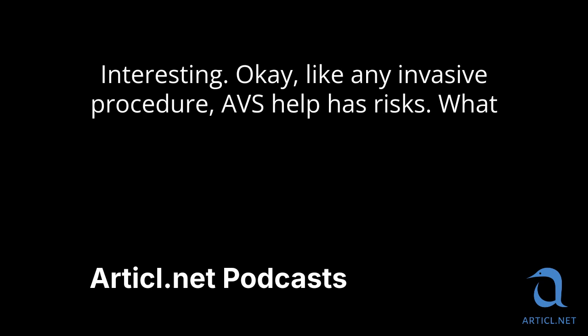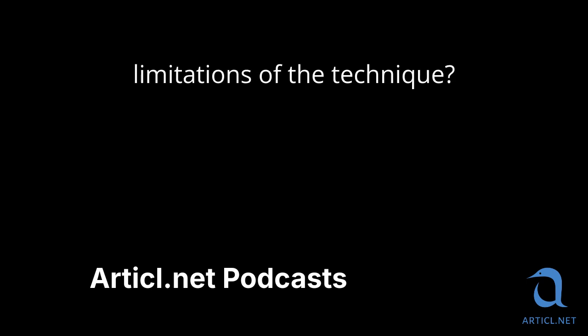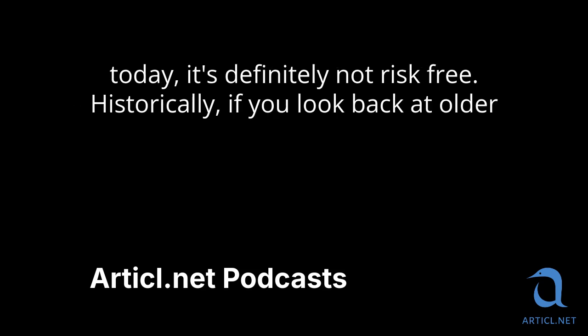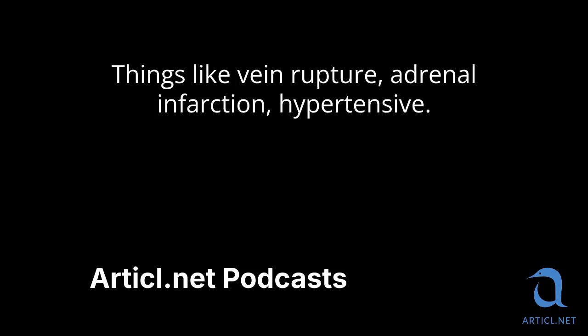Interesting. Okay. Like any invasive procedure, AVS has risks. What should we be aware of regarding complications and also the inherent limitations of the technique? Absolutely. While AVS is generally considered safe in experienced hands today, it's definitely not risk-free. Historically, if you look back at older papers, complication rates were reported higher, maybe around 10%. Things like vein rupture, adrenal infarction, hypertensive crisis.